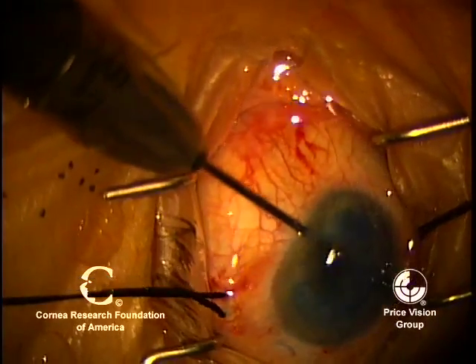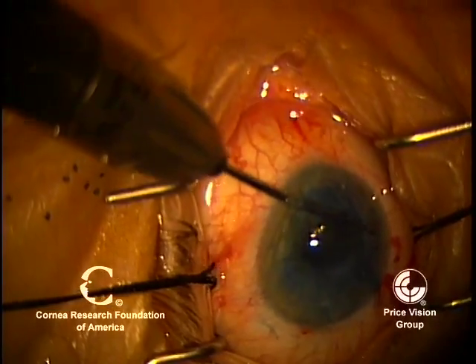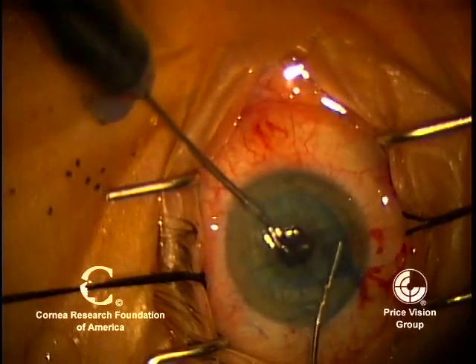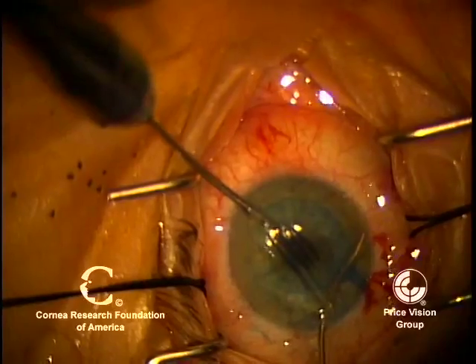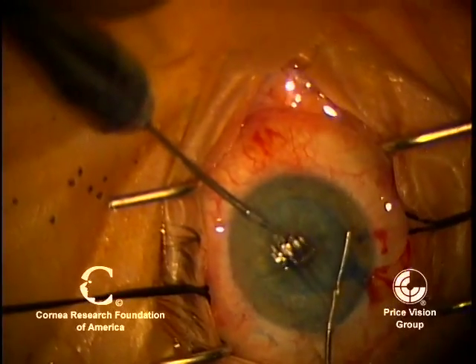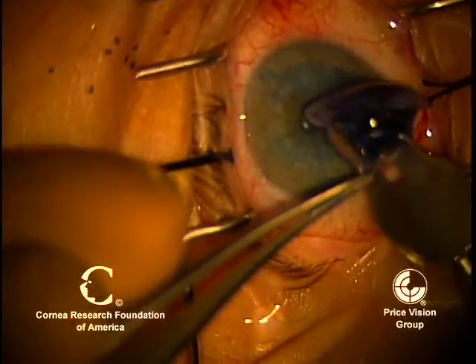These are intraocular scissors that we're going to use to make an iridotomy inferiorly at 6 o'clock. One wants to make not just the iridotomy, but also to go in with the bimanual I/A and remove loose pigment epithelium. That will help minimize the chance of pupillary block.